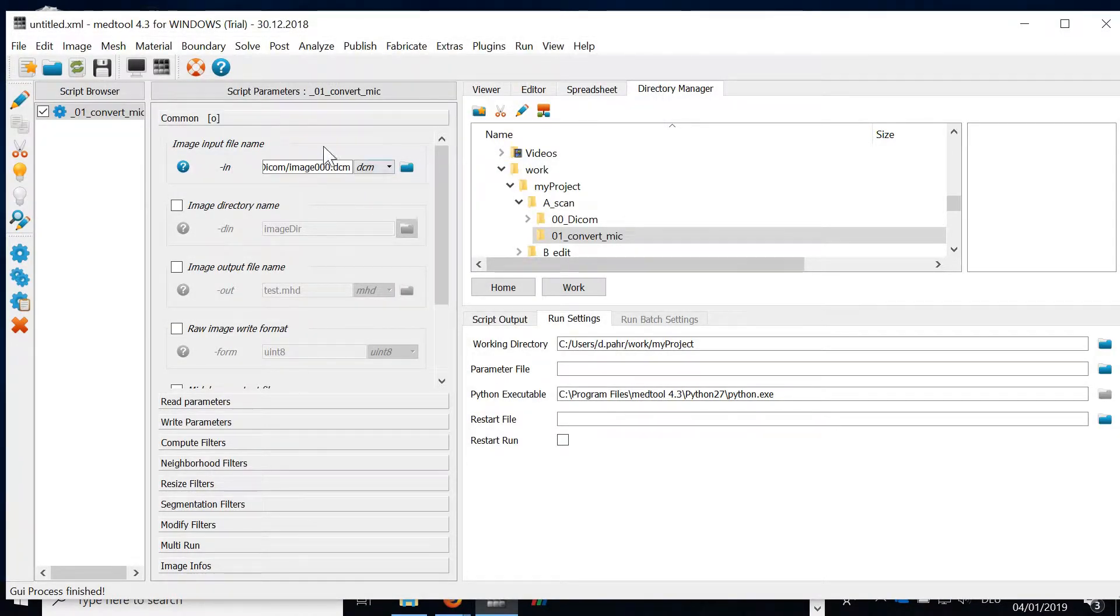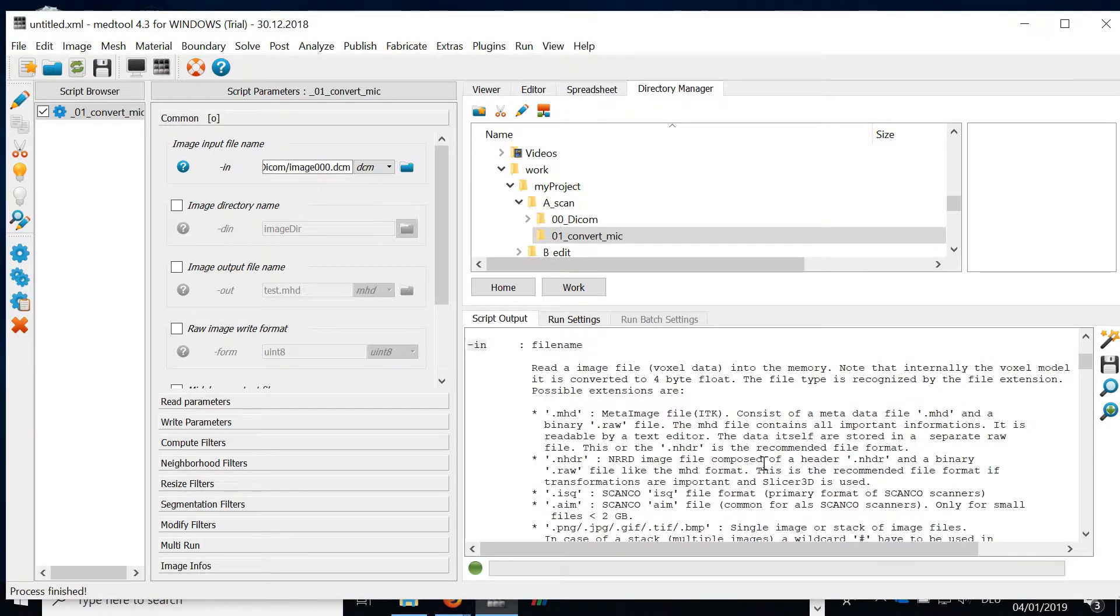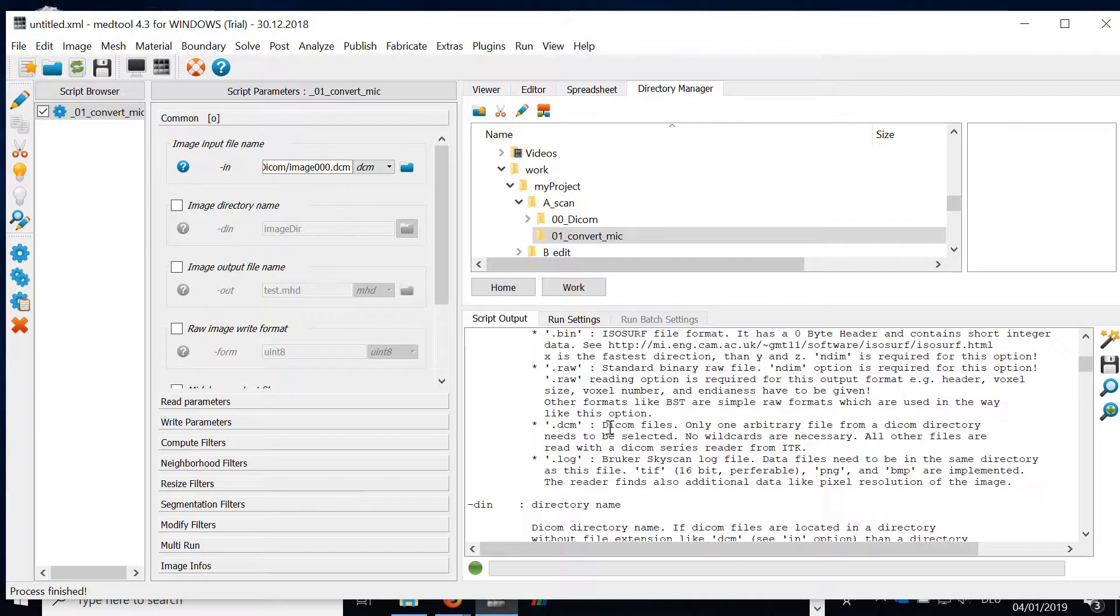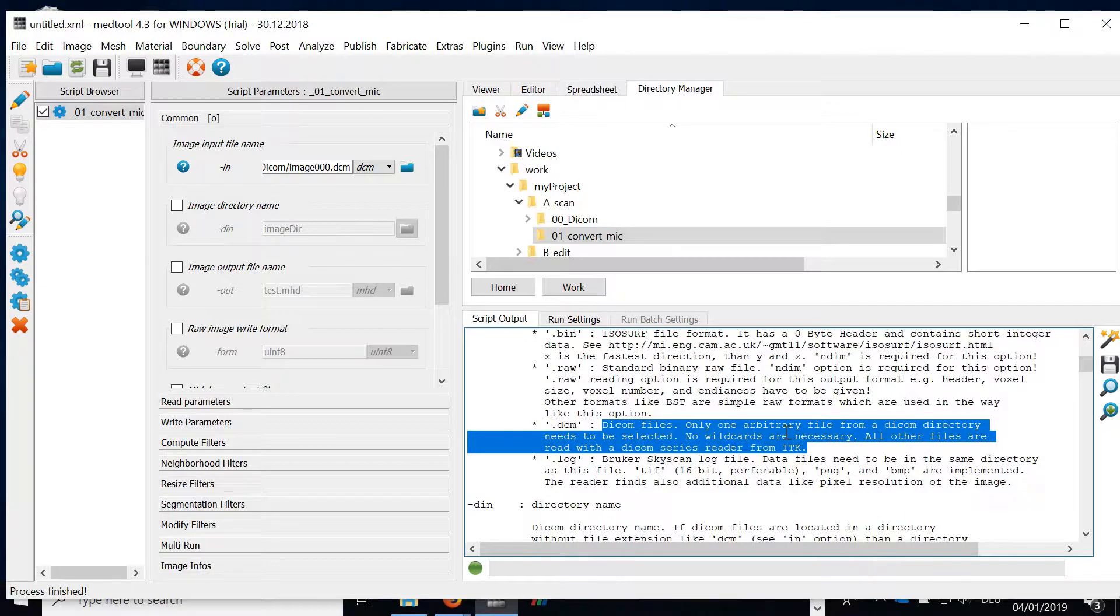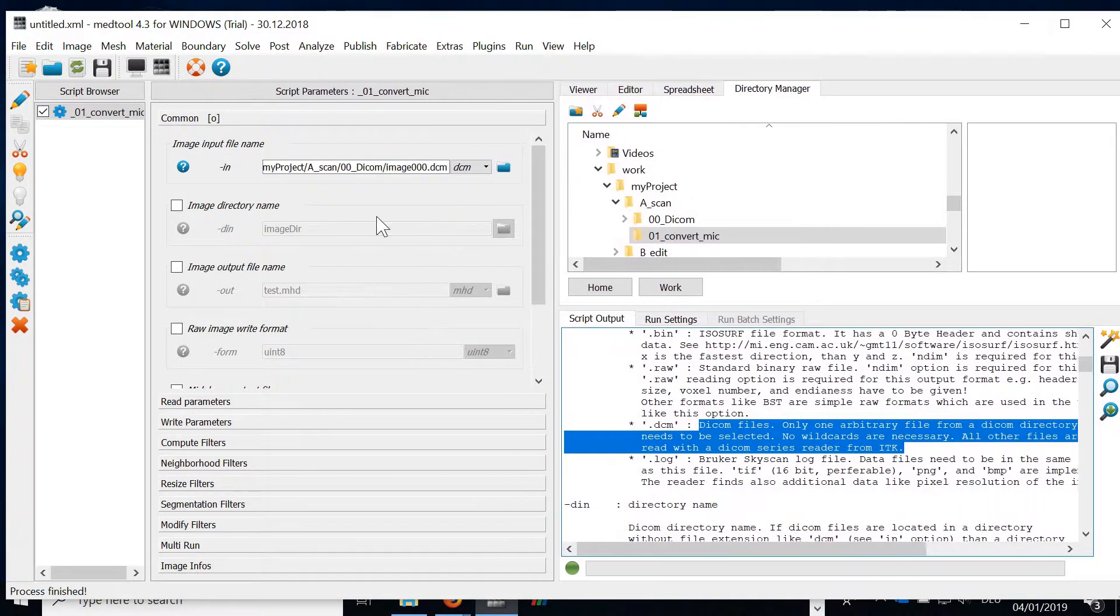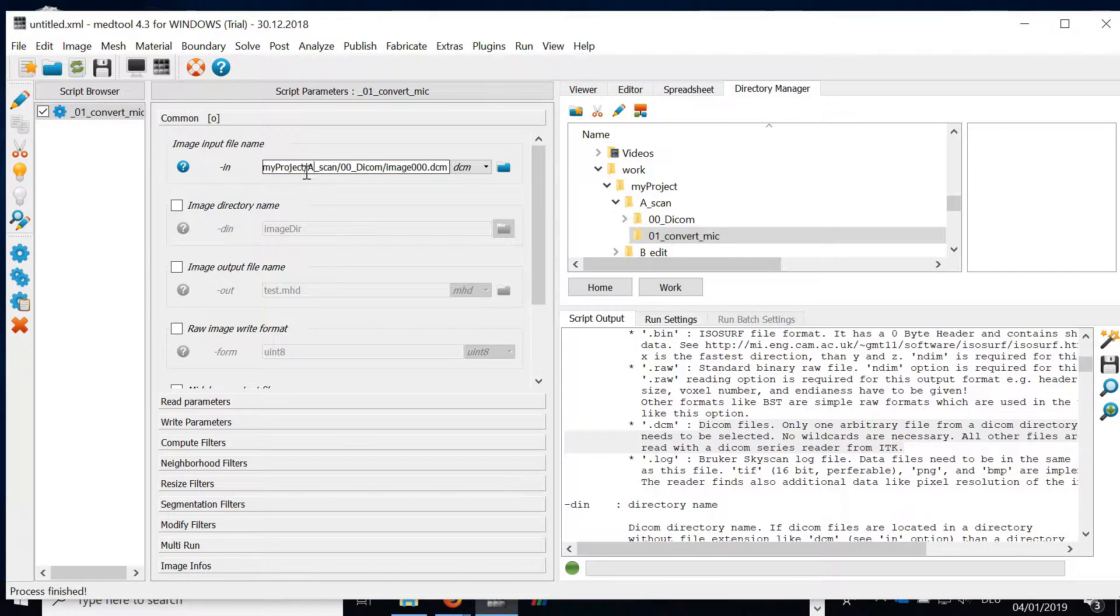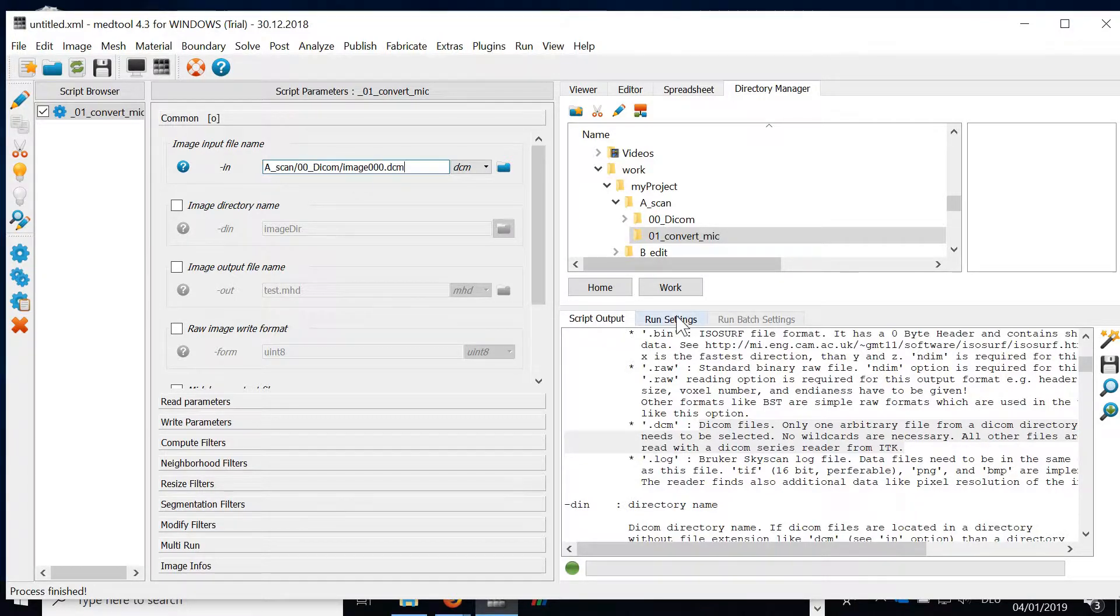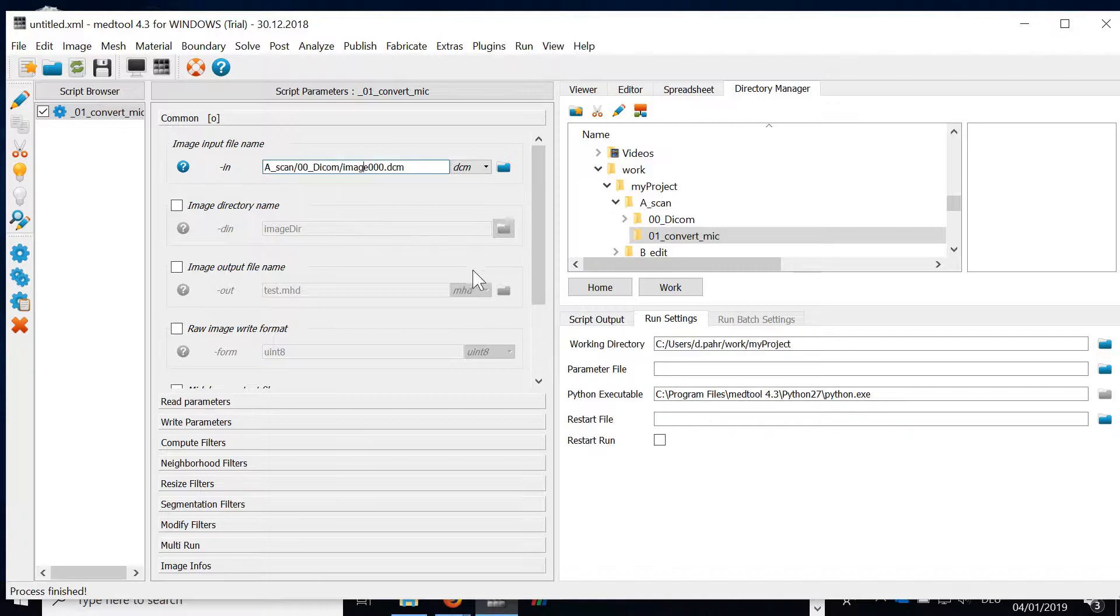If you'd like to know what this option is doing simply click here on the help. In case of DICOM files it tells you that you can select an arbitrary DICOM file and the reader detects all other files automatically. We have here the full path. This full path is not necessary because this part of the path is the path to the project. We can delete it because we already have the path here in the working directory which is automatically appended to this file.